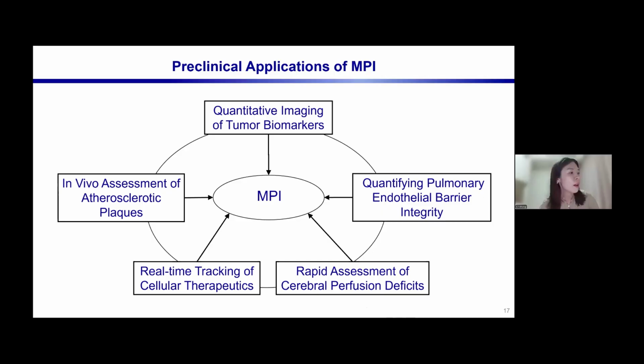Okay, so now let's dive into our preclinical research across various disease models. These applications are made possible by the flexible surface functionalization of the SPIONs, the magnetic nanoparticles. By synthesizing these functional particles, we can ensure the particles target specific lesion areas, enabling high performance molecular imaging of diseases.